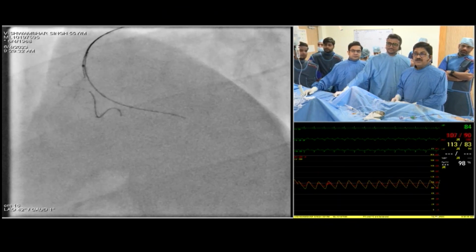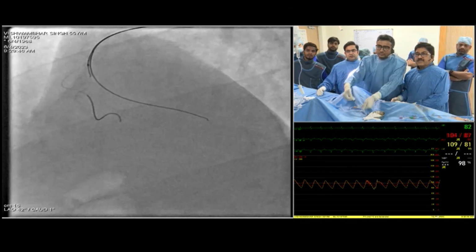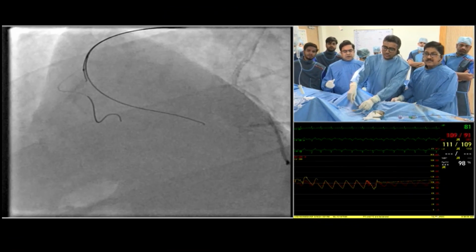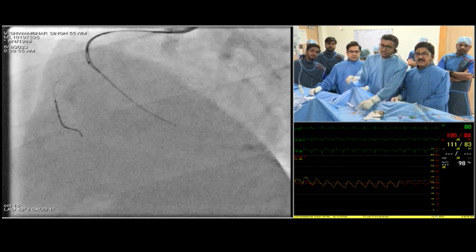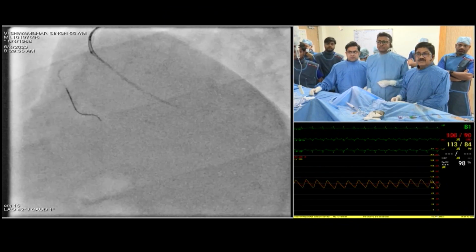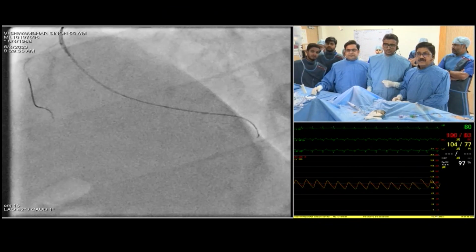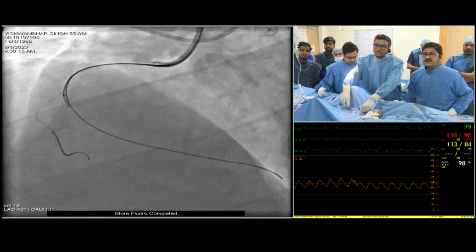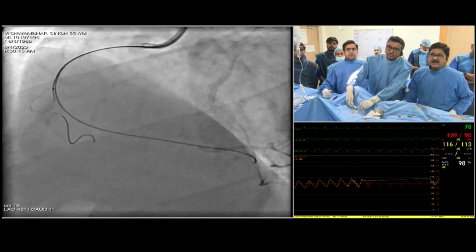Dr. Goel, how about your feeling? Is it free? How is the feel passing through this guide wire? Still subintimal? Looks okay. Let me see where it is. Yeah, it's good, the feel is okay. That's where it is. Left injection, please. Yeah, definitely, I think I'm okay.